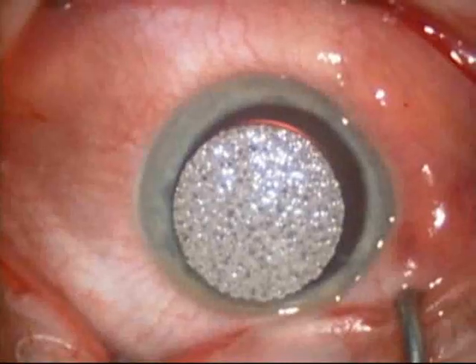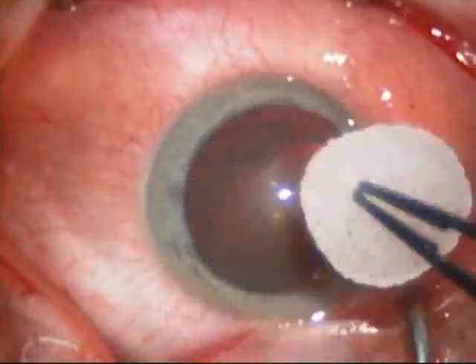Welcome. I'm Dr. Stephen Cohen and I'll be narrating this video showing a macular pucker surgery.